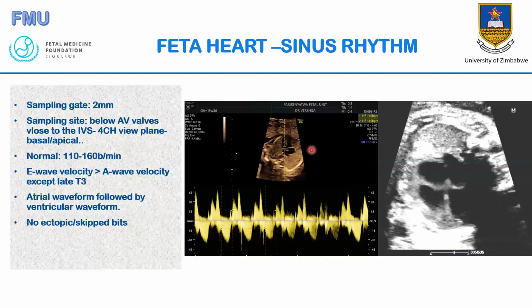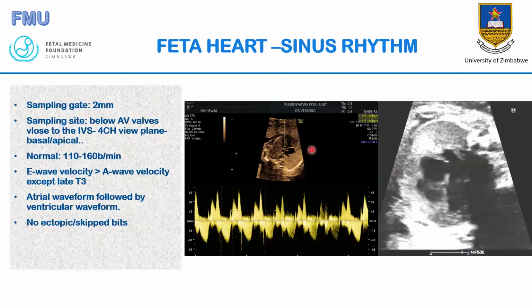My next slide is on heart rate examination.